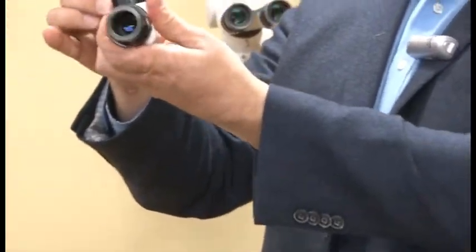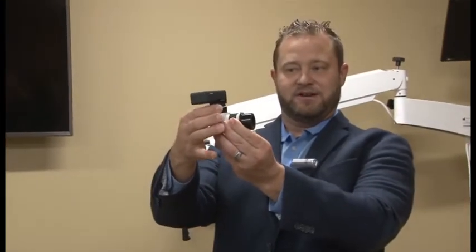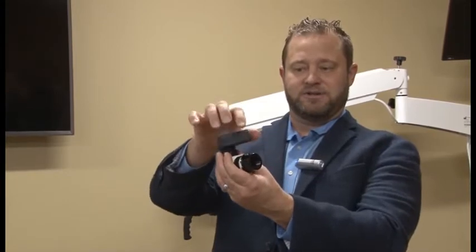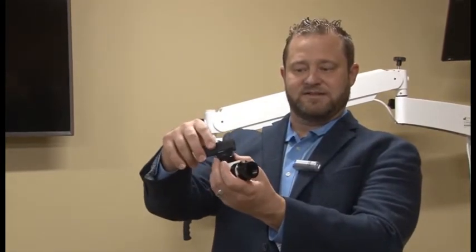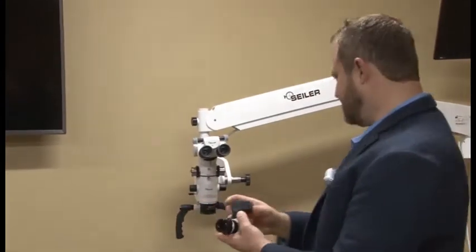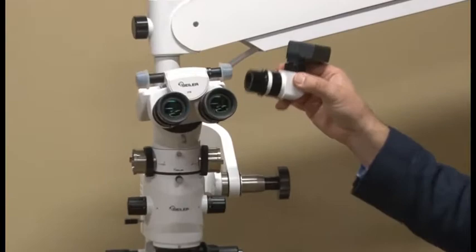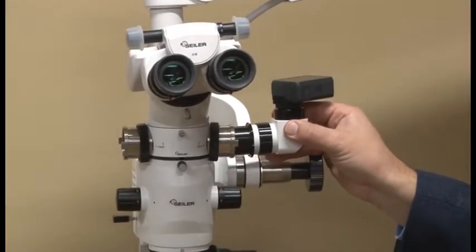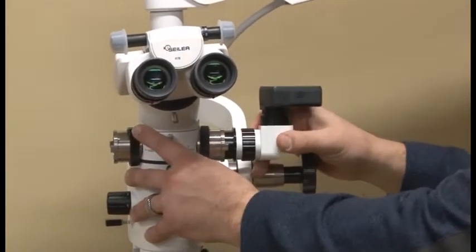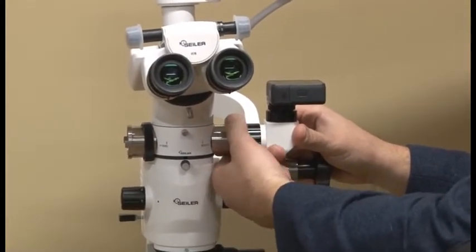Orientation — this ring down here is going to be the locking ring. So wherever I want to orientate this, then I would lock this down. We have our beam splitter. We're going to slide this in directly into the beam splitter. I lock it down.